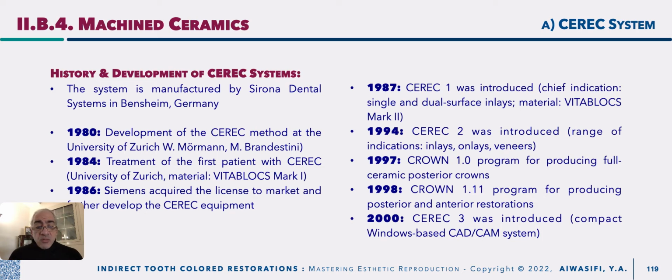In 97, the Crown 1.0 program was produced to cut full ceramic posterior crowns. Then it was modified after that by 1 year. In 98, they developed the Crown 1.11 program for producing posterior and anterior restorations. In 2000, CEREC 3 was developed, introducing a Windows-based CAD/CAM system.